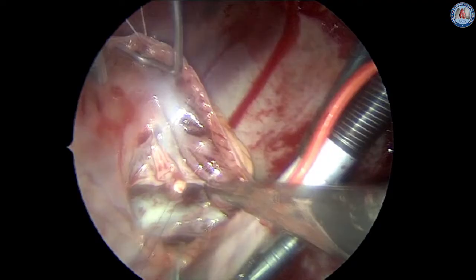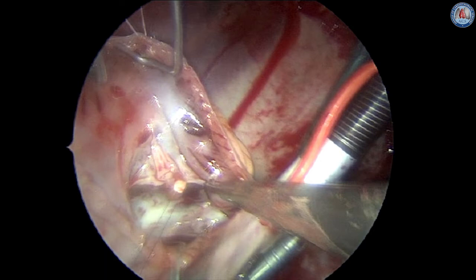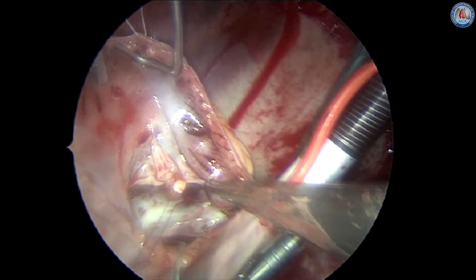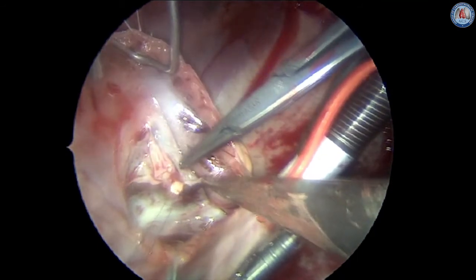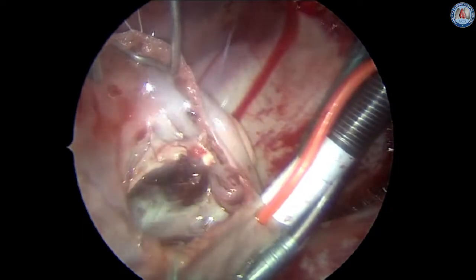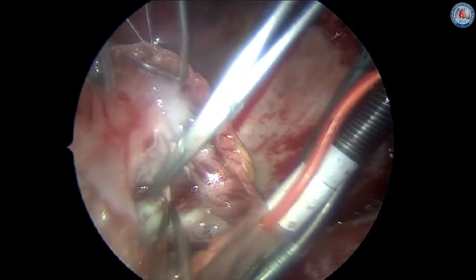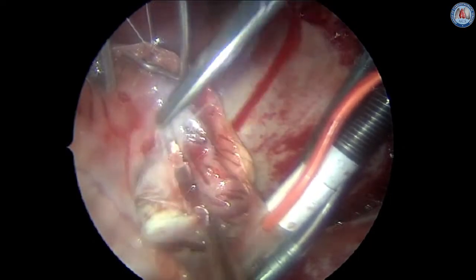We inspect the tricuspid valve and observe a perforation of the anterior leaflet, and, as well recognized on the video, there is one vegetation adhered to the free edge of the anterior leaflet. There is also a rupture at the insertion site of a primary cord. The other leaflets are not damaged and the annulus is not dilated.